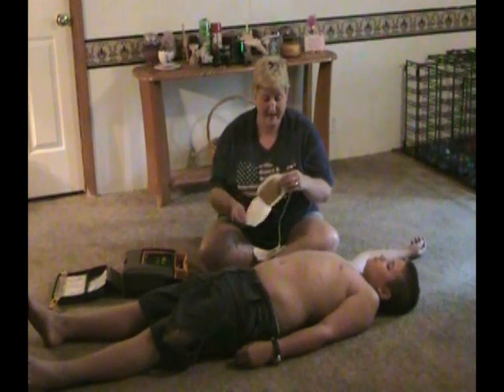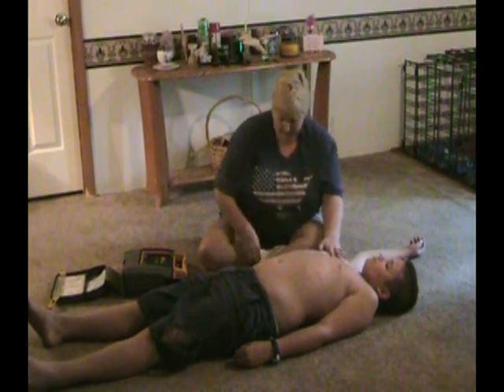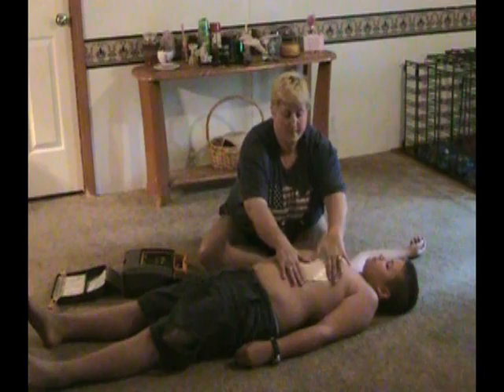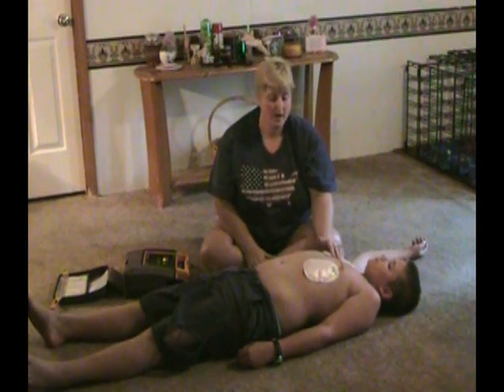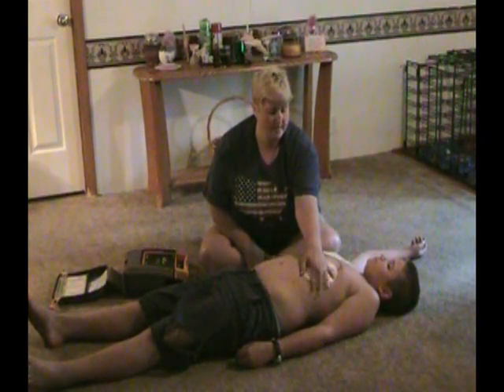We want to put one pad on the upper right of the chest. It's got pictures on the pads if you forget where they're supposed to go. One on the lower left, again, you have a picture there. You want to make sure before you apply the pads that the victim's chest is dry. Wipe off any sweat or water that may be there. Electricity and water do not mix.